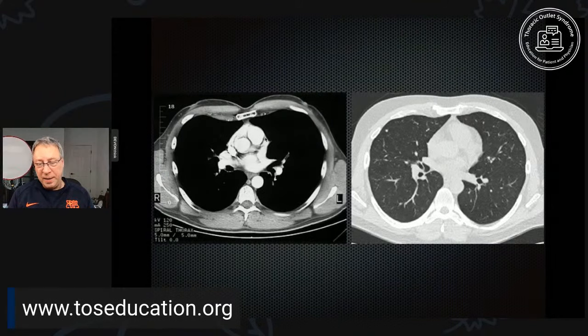Now, the image on the right, if you manipulate the image on the left, you can now make the lungs show up, and you can see the structures within the lungs. Now, you see that the bones and the muscles and the fat are all kind of a light gray, and they're harder to distinguish from one another.